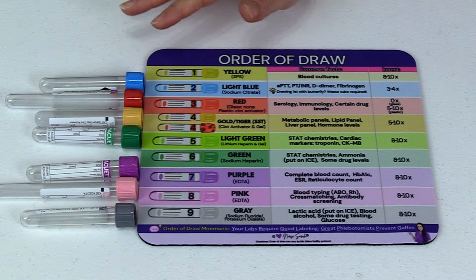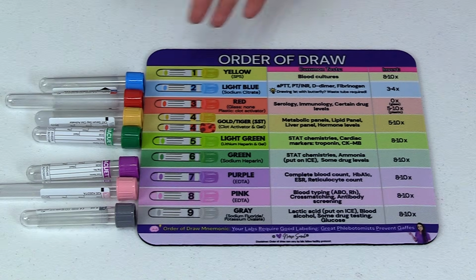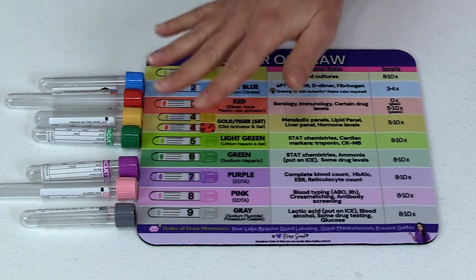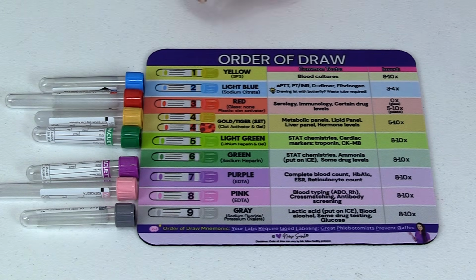Now, one important thing you must remember about your lab tubes is the order of draw, because sometimes a patient may just have one lab ordered, so you just have to do one tube. But sometimes they may get the whole rainbow, and you've got to know how to put those tubes on in a specific order, because we don't want to risk contaminating tubes with certain additives. So you're going to follow an order of draw.